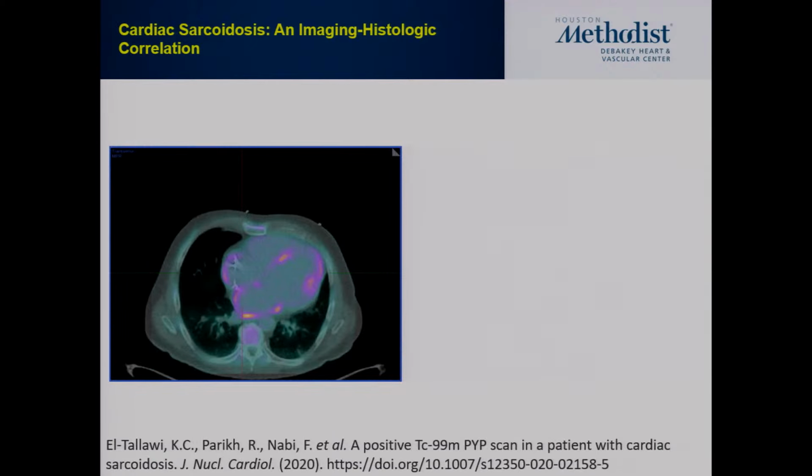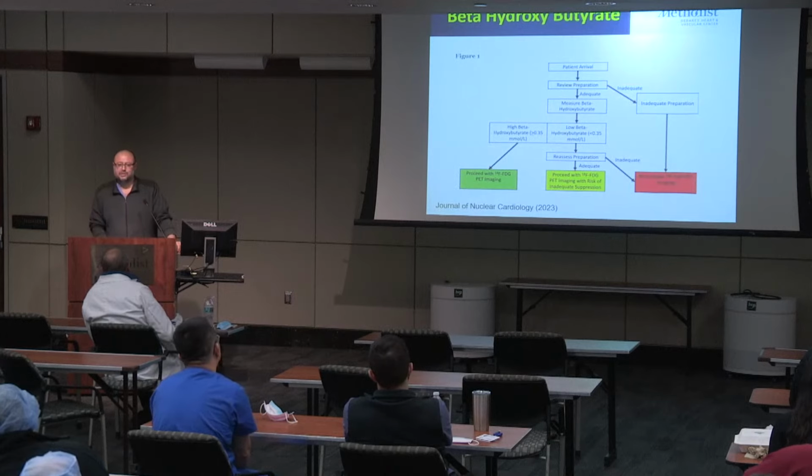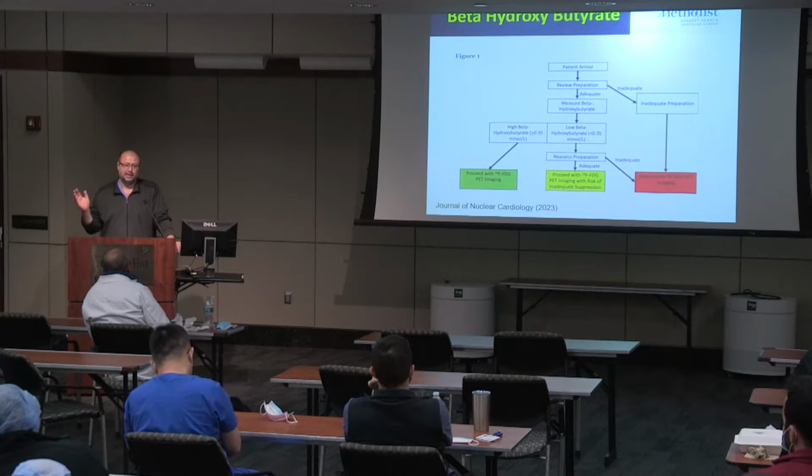So, what's the lab turnaround time to get that test? It's about 2 hours for us. So by the time we do perfusion, we're not holding patients for that. For outpatients, we do it as they come, but we have that to guide us for the interpretation. But for inpatients, because this is where we had a lot of failures, they order it at 5 a.m. By the time the test is ready to be done at 8 a.m., we will have the results.